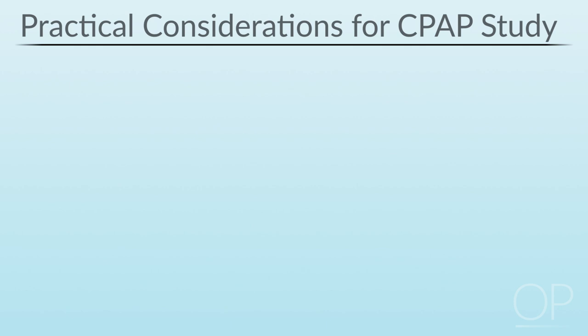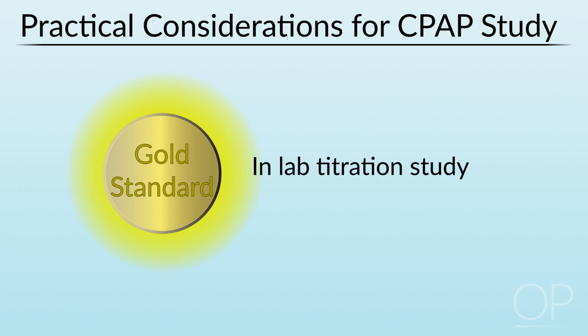What are the practical considerations of ordering a CPAP study? So we get asked multiple times what are the things I need to worry about or take into consideration when I order a CPAP study? The in-lab titration study to identify the appropriate pressure for a child is the gold standard.